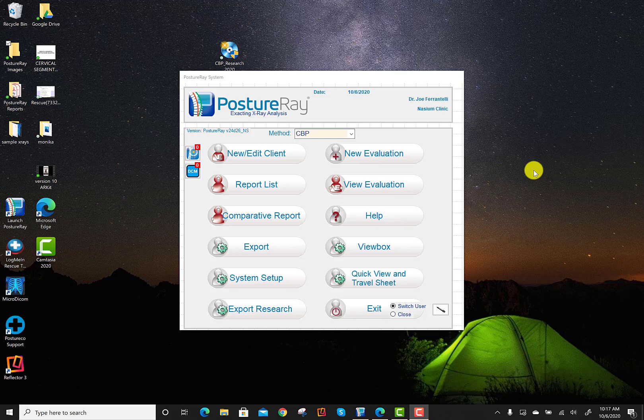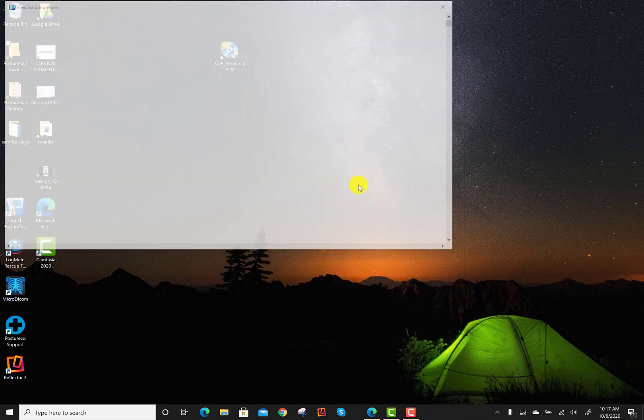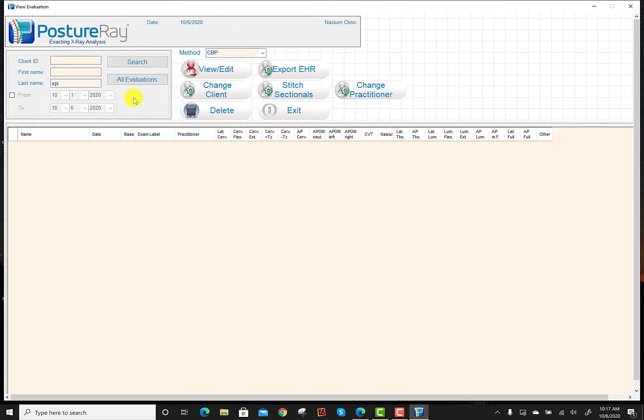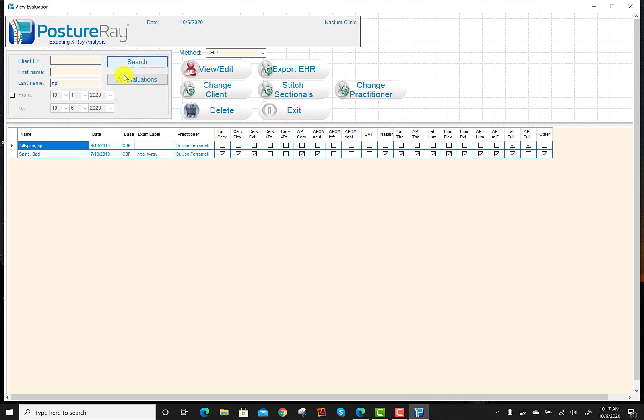In this tutorial, we're going to show you how to export other views by default or even look at them in your reports. So the first thing is, let's open up an examination so that you can see what I'm talking about. Make sure that we're all on the same page.